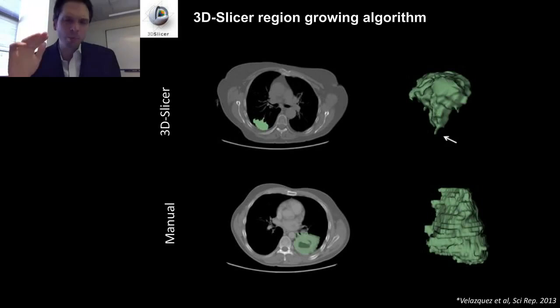you can really clearly see this slice-by-slice effect. So the radiologist segments one slice and the other, and then the other, and often does not go back to the upper slice. So you can really see that manual segmentations often don't account for this full three-dimensional phenotype.